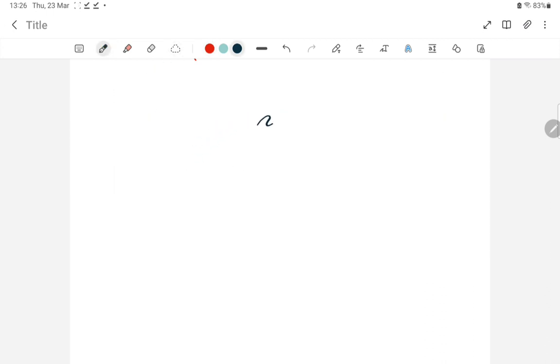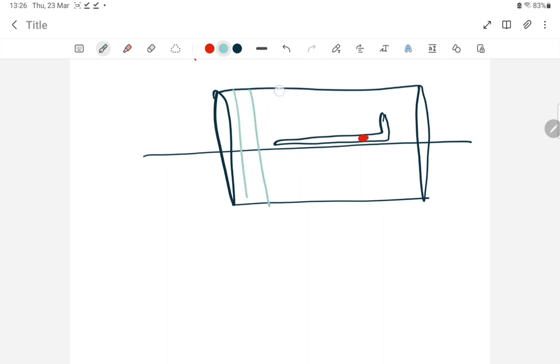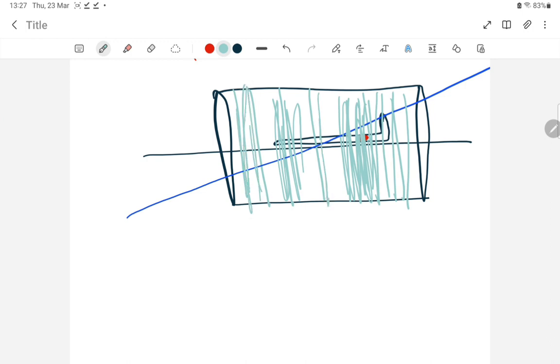Now you saw that there was a patient in the magnetic field. I'm using the same diagram again and again, and there was a tumor. There was a homogeneous magnetic field. Then you applied a gradient. Suppose one gradient you applied, and this gradient disrupted the main magnetic field, and the field homogeneity got disturbed. Some places are too dense, some places rare, again dense, again rare, like this. Now the field gradient is applied, and we collected the signal.